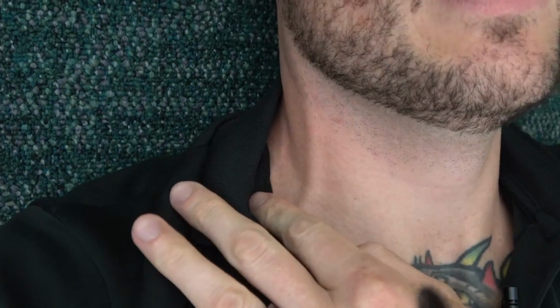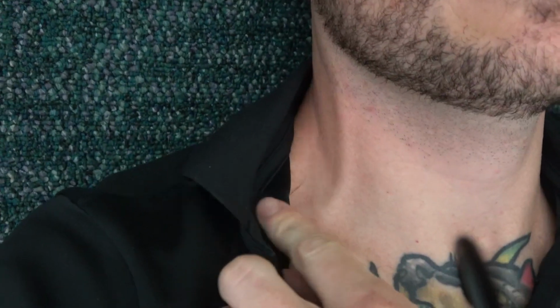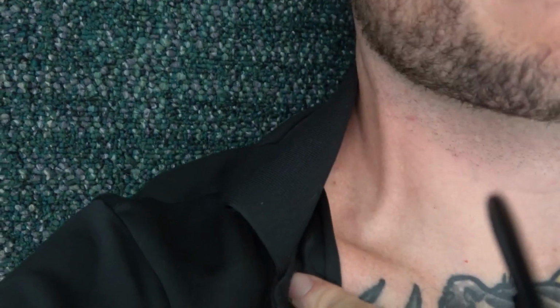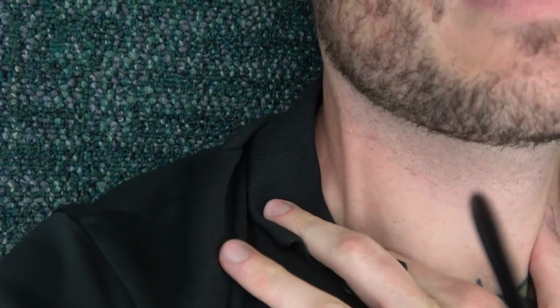All right. Now you can really see, it looks like it's quite a bit larger here, okay? Let's make them pop even. I'm just gonna take my index and put some pressure right above the collarbone where you can see that EJ go in. I'm just gonna put some pressure on there, okay?